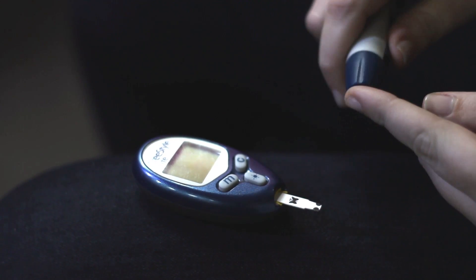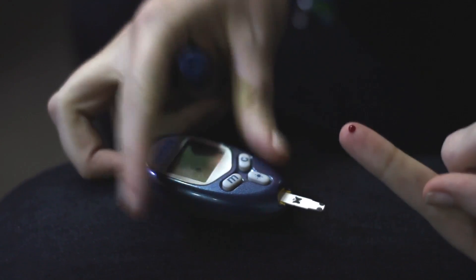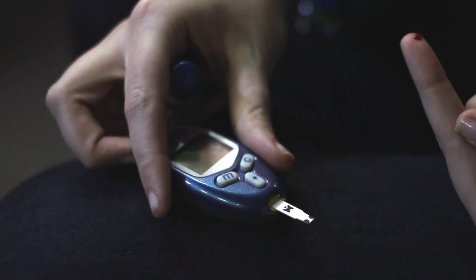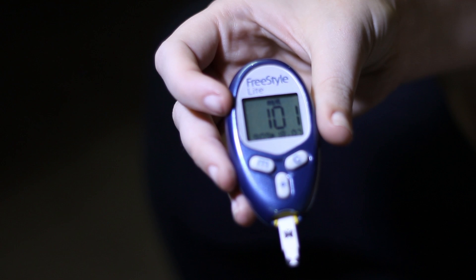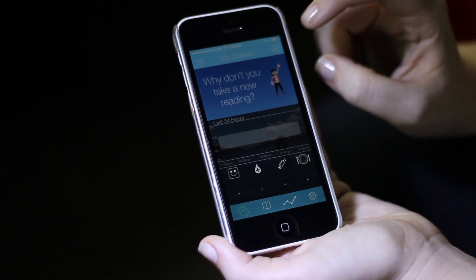Now you're going to take your reading so we can have some data to upload. So we took our reading, and now we're going to upload it — let's sync our data.